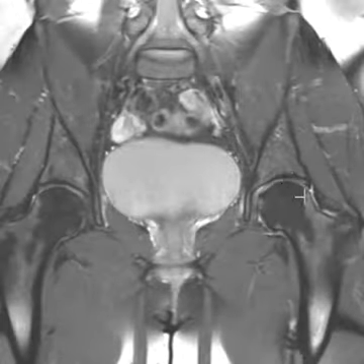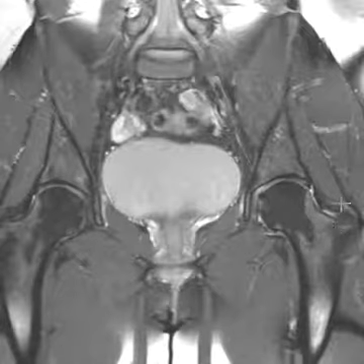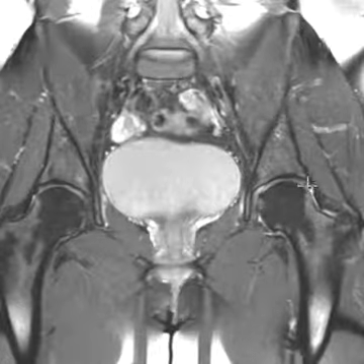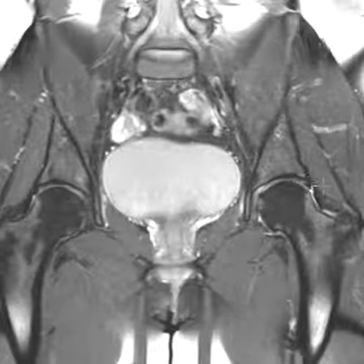Hello, this is Dr. Gay from FirstLake MRI, and this is a patient who has a tear of their left hip labrum. The tear is in the posterior labrum, not a place we see tears commonly. Usually the tear is in the superior hip labrum.